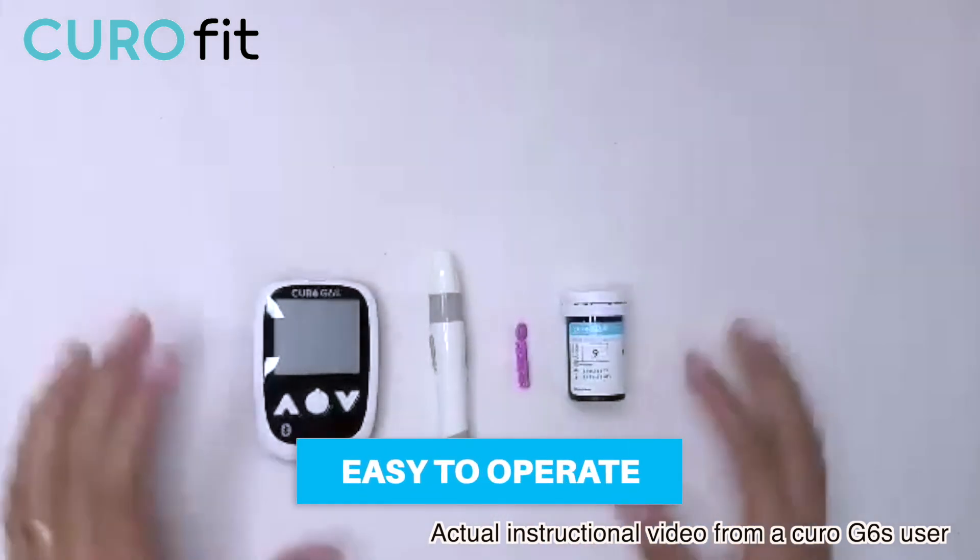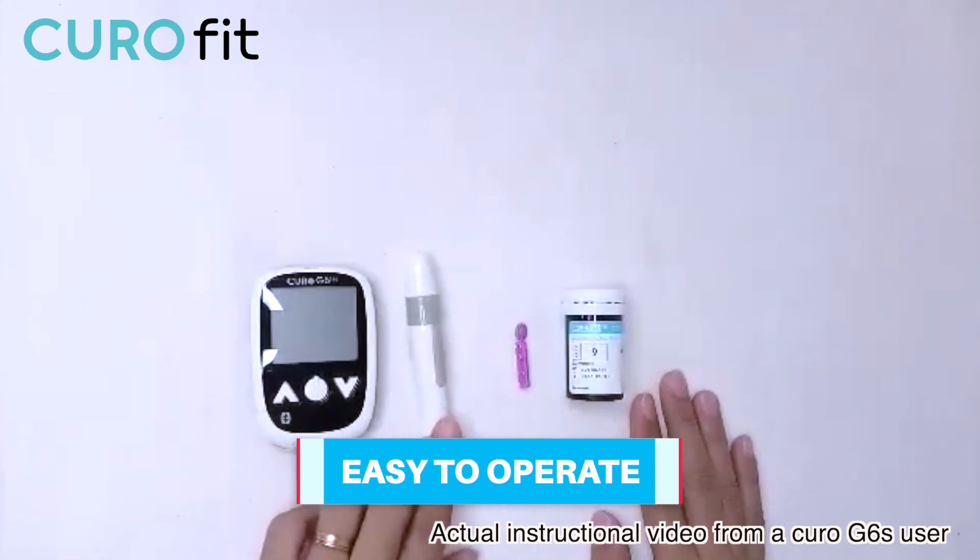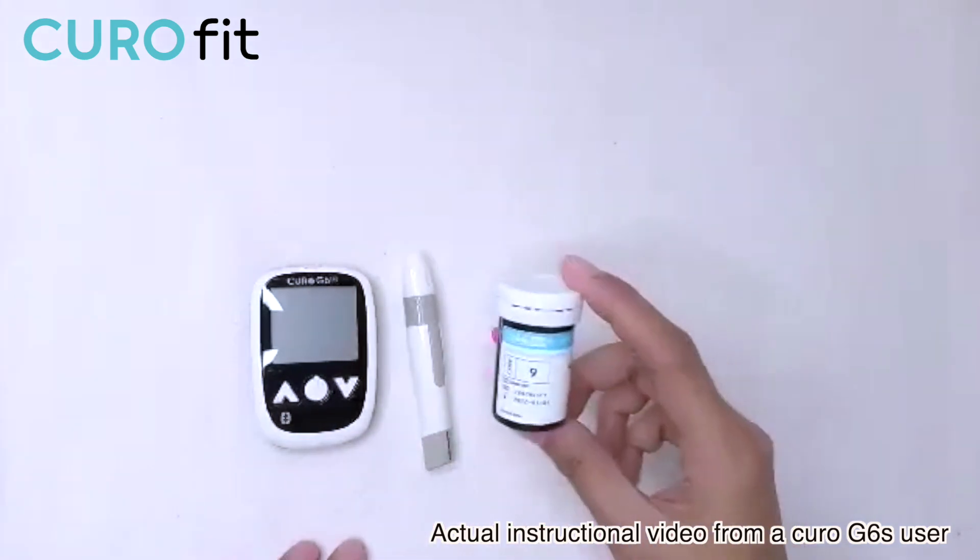After washing our fingers, let's set up everything. We will be needing the Kiro G6S, the lancing device, the lancet, and the test strip.